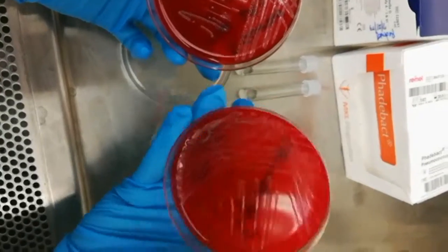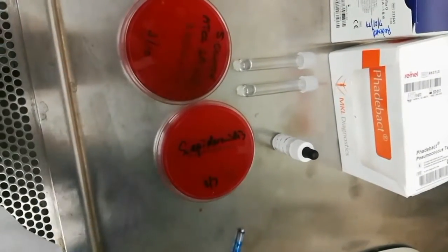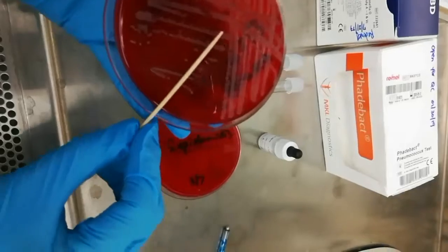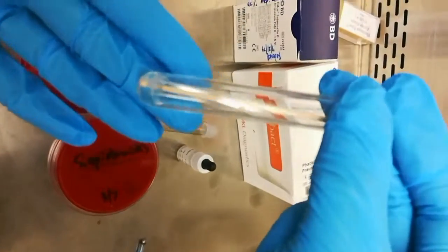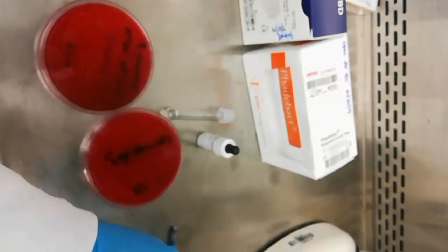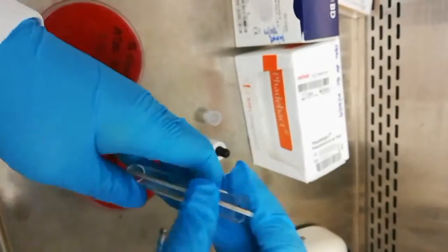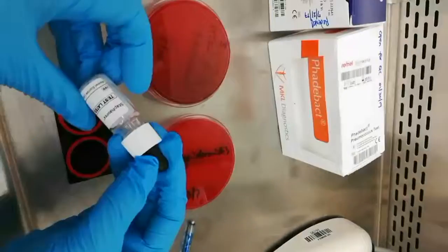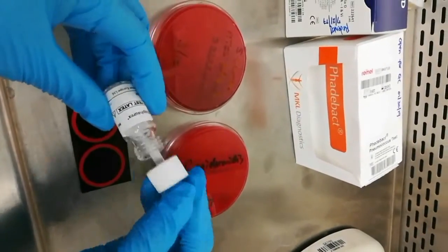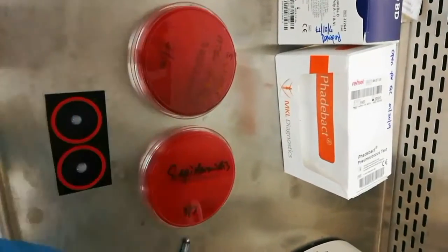For Staph aureus, morphology is mostly beta hemolysis on blood plate. For coagulase-negative Staph, morphology can be beta hemolysis, non-beta hemolysis, or slightly beta hemolysis. The biochemical tests for Staph aureus: catalase needs to be positive and coagulase test needs to be positive. For coagulase-negative Staph, such as Staph epidermidis, catalase needs to be positive and coagulase test needs to be negative.